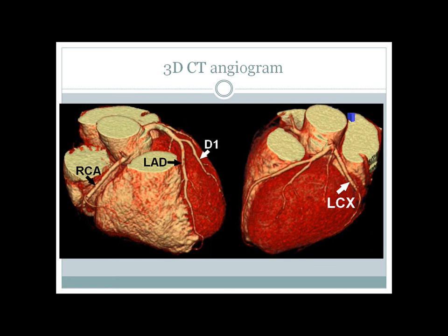Here you can see a very good 3D reconstruction of the heart along with the vascular territories. This is the aorta and the ascending aorta. This is the right coronary artery running from the aorta through the atrioventricular groove, giving off branches — this is probably the right ventricular branch — and then it courses downwards and behind.